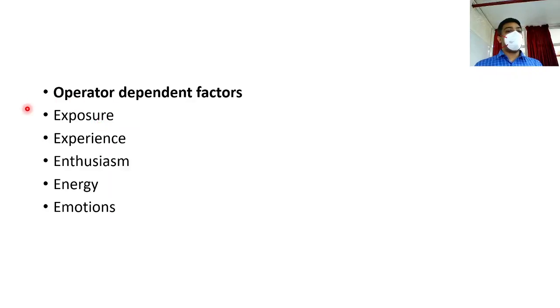This is very important: the radiation exposure will be very high when we are doing a CTO procedure. The patient may even get radiation-induced necrosis. After the procedure is over, we may find that the patient has a radiation-induced injury on the back. Then the experience of the operator is very important. The more the experience, the better, and the higher the chance of opening up the CTO.